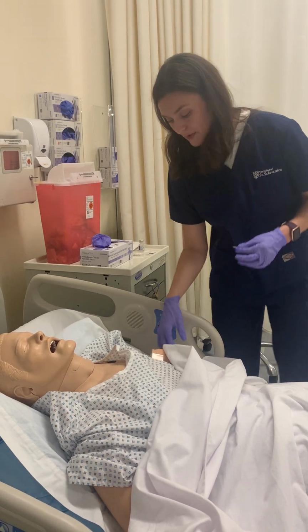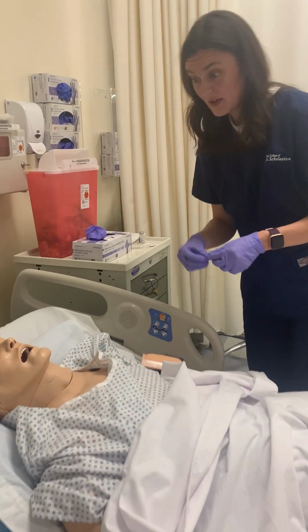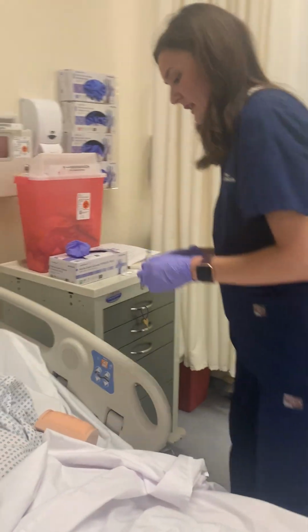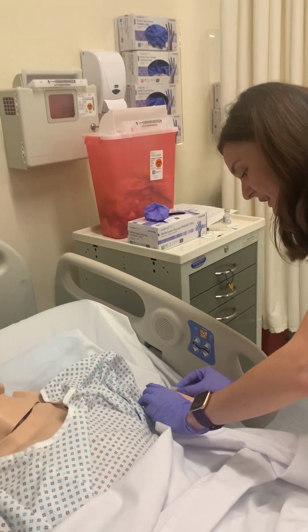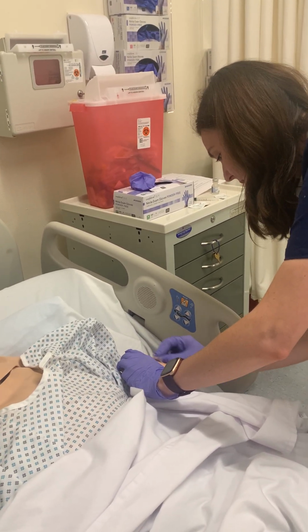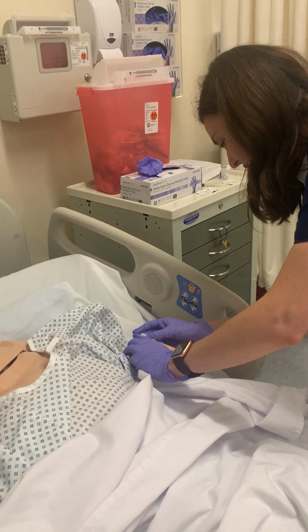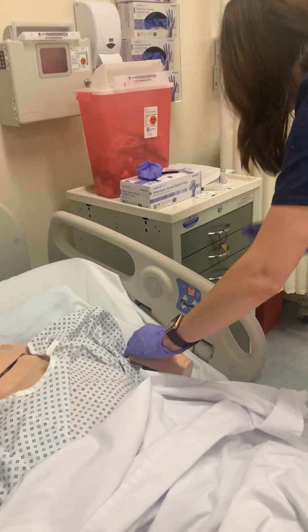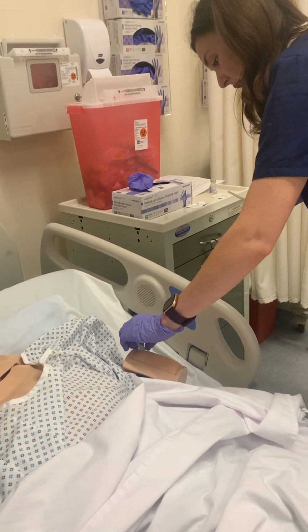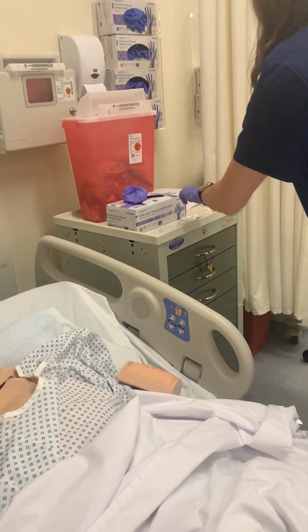So now I'm going to just expose enough skin. We're going to do the deltoid muscle. I'm going to clean the deltoid muscle starting from the inside out for about 15 seconds. Okay, and I'm just going to mark my little spot there. I've done that. Oh, I forgot to do something else. So we're going to backtrack for a second. Oh, that fell.